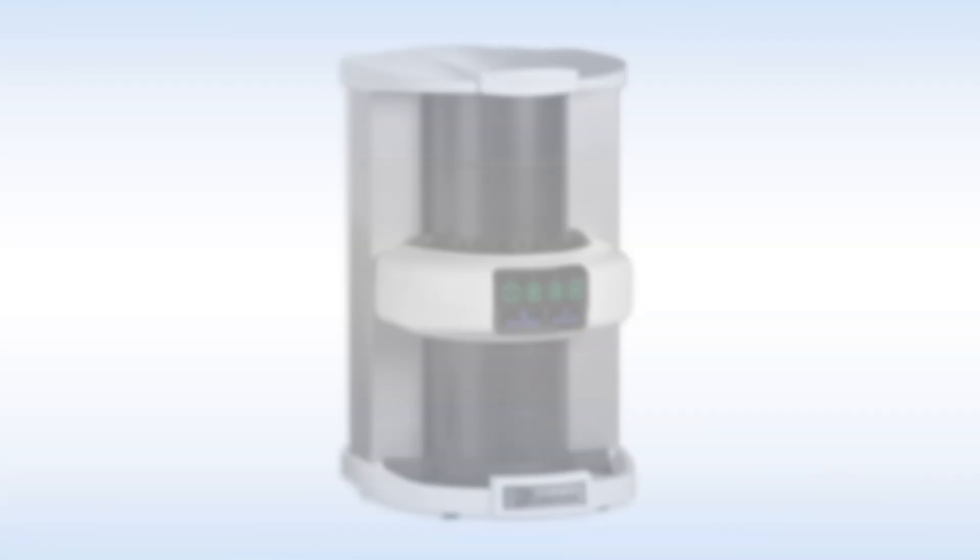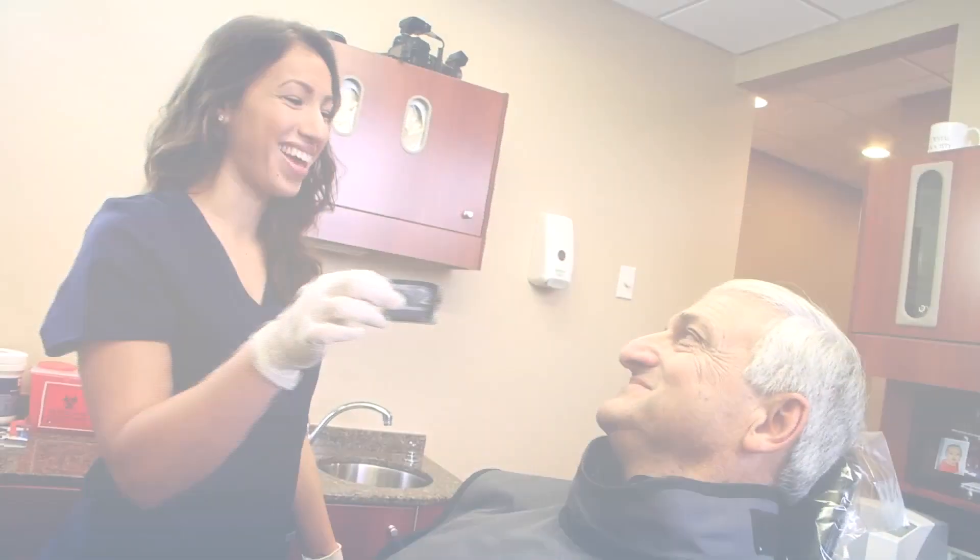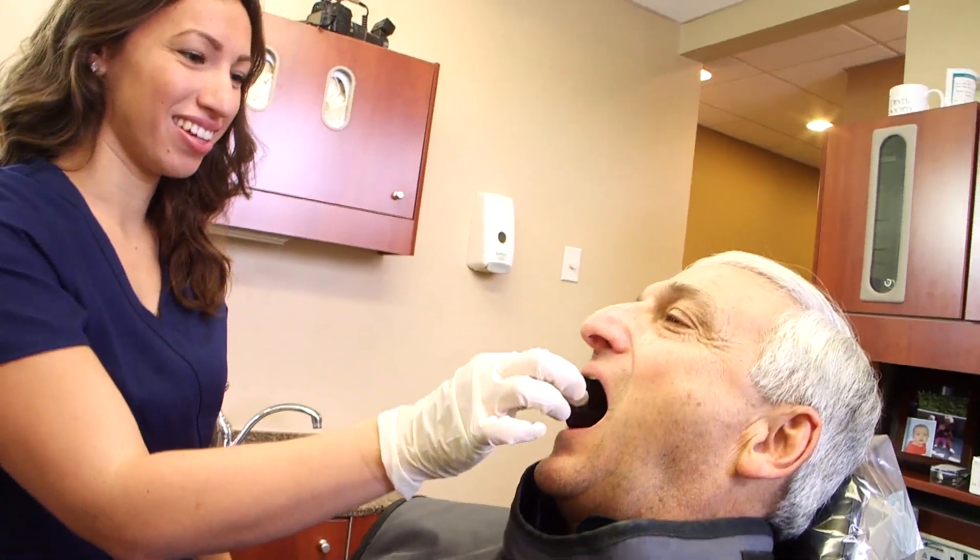Choosing ScanX Digital Radiography by Air Techniques was one of the best decisions I made for my practice. I wanted a system that would make transitioning from film to digital seamless. ScanX uses the same x-ray technique and patient positioning as film, so my team had absolutely no learning curve.